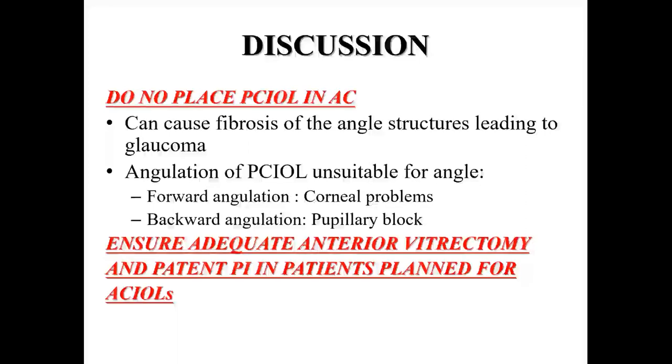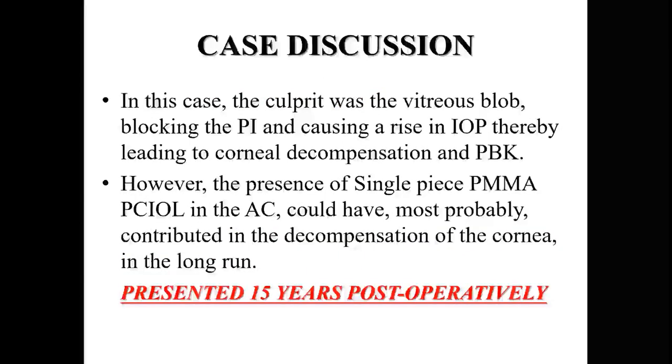Also, when you are placing any IOL in the anterior chamber, you have to ensure adequate anterior vitrectomy and a patent PI in patients who are planned for AC IOLs. So in this case, as I mentioned, the culprit was the vitreous blob, which was blocking the PI and causing a rise in IOP, thereby leading to corneal decompensation and pseudophakic bullous keratopathy. However, the presence of a single-piece PMMA PC IOL in the AC could most probably have contributed to the decompensation of the cornea in the long run. But the only interesting factor in this case was that the patient presented 15 years post-operatively.